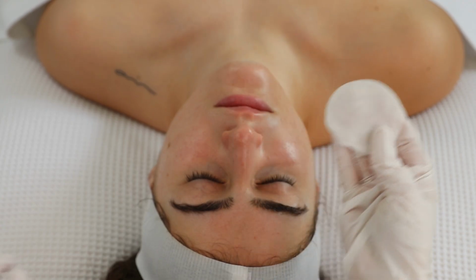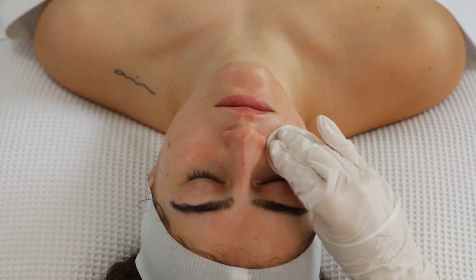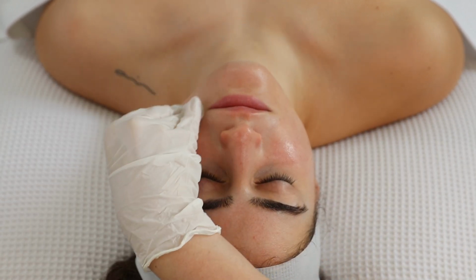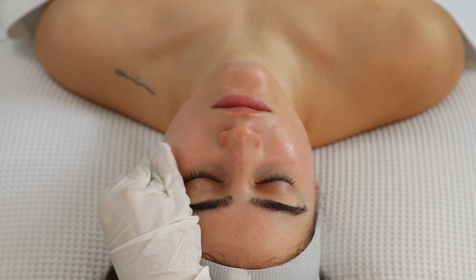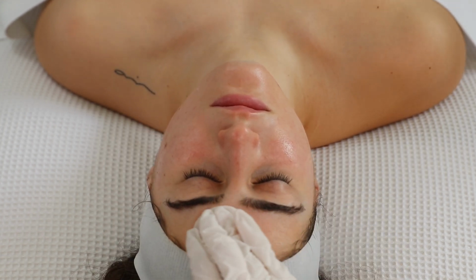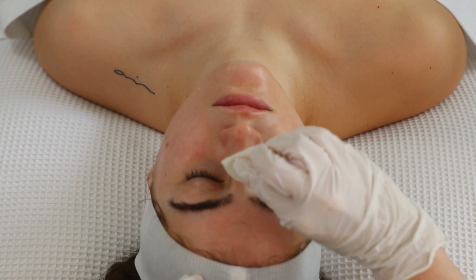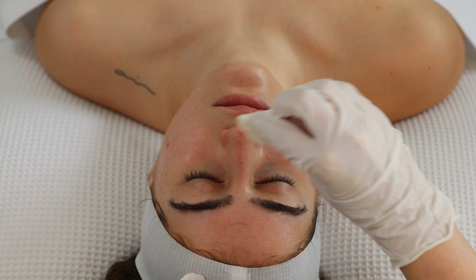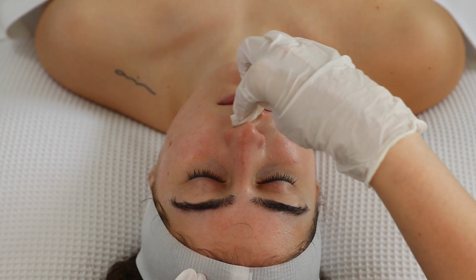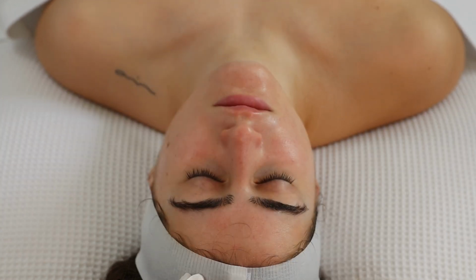Apply the solution using a cotton pad, starting from the right side of the face near the chin area, and with this you're going to move upwards towards the jawline, making your way up to the cheek. Move on to the other side of the face, and you're going to do exactly the same. Start from the chin area, move up towards the jawline and then up to the cheek. Go over the forehead, moving outwards towards the temples on each side. Then you need to go over the nose, upper lip, and then finally finish off at the chin area. Once you've covered all areas, you can move on to applying the chemical peel.